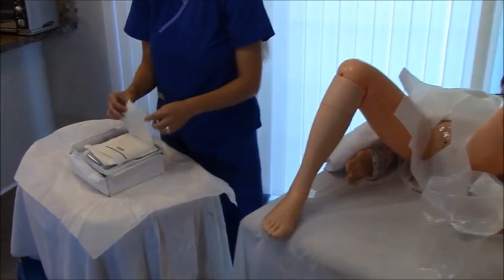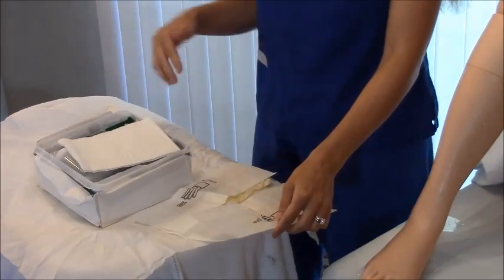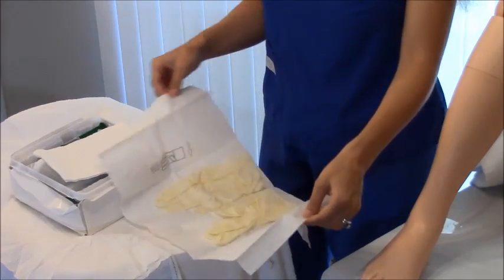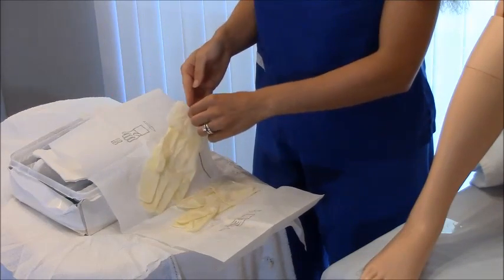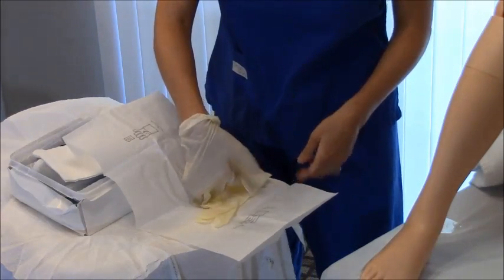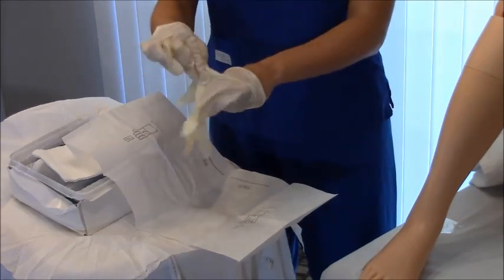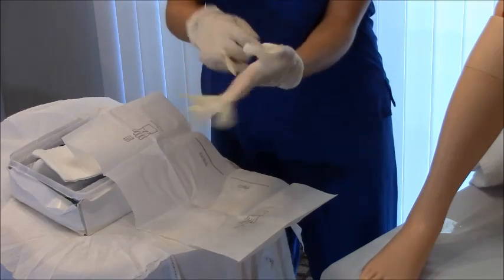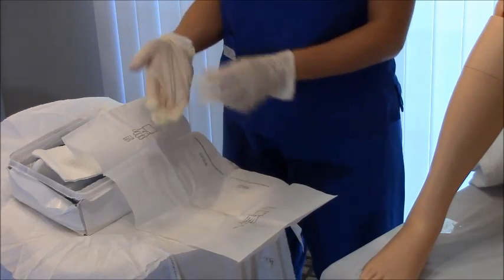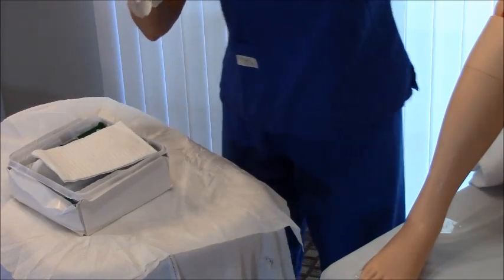Next, put on your sterile gloves. Once your sterile gloves are on, you can access everything in the kit because you will be sterile. There is a specific technique to putting on sterile gloves — I have a separate video on that, so check it out if you need to. After putting them on, you can adjust them as needed since they sometimes stick.